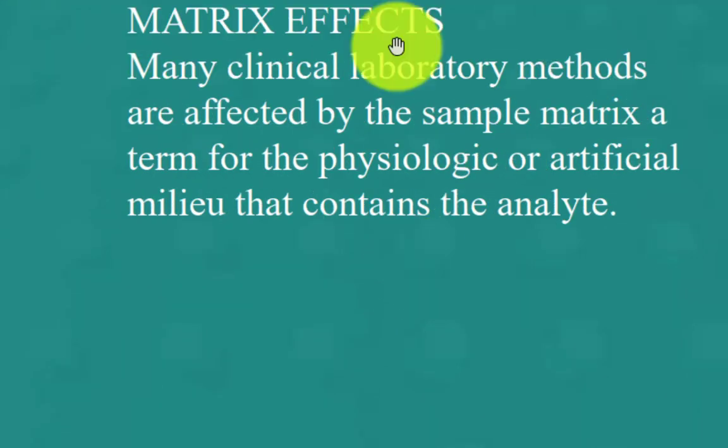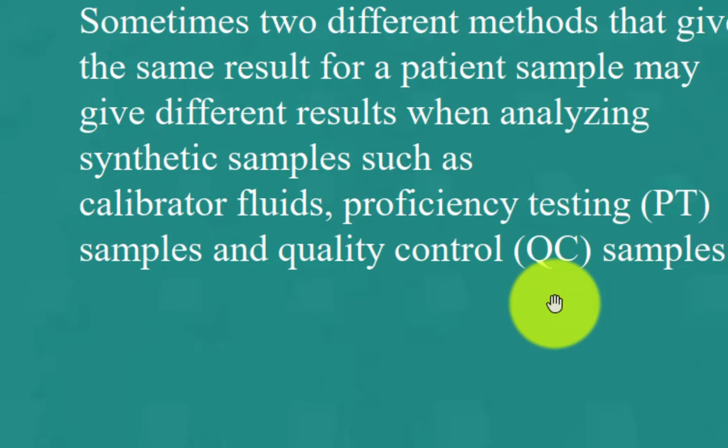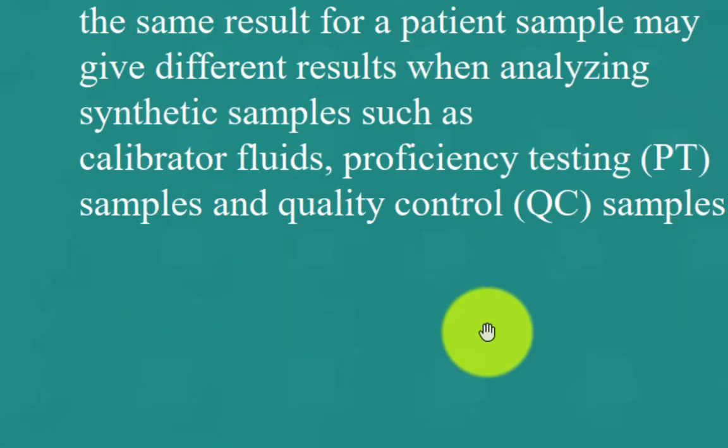Matrix effects. Many clinical laboratory methods are affected by the sample matrix, a term for the physiological or artificial milieu that contains the analyte. Sometimes two different methods that give the same result for a patient sample may give different results when analyzing synthetic samples, such as calibrator fluid, proficiency testing samples, and quality control.